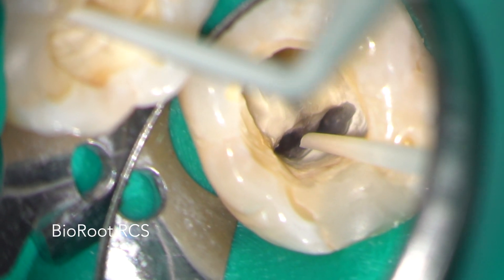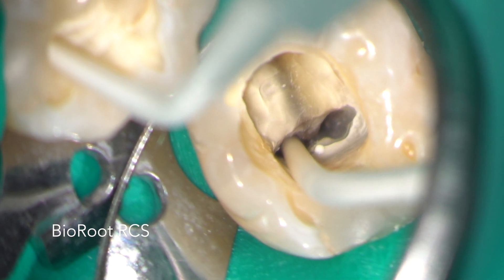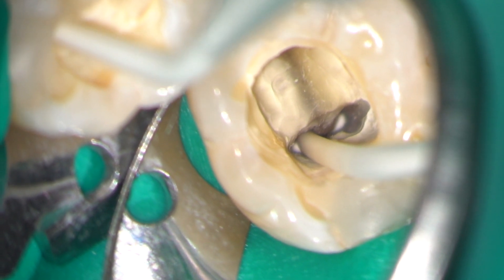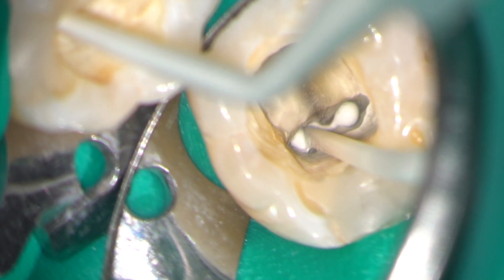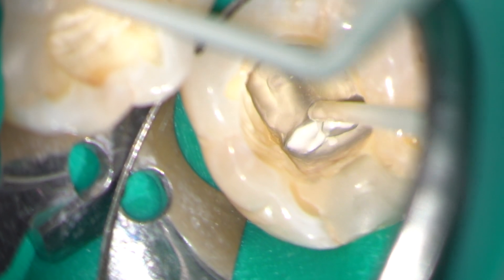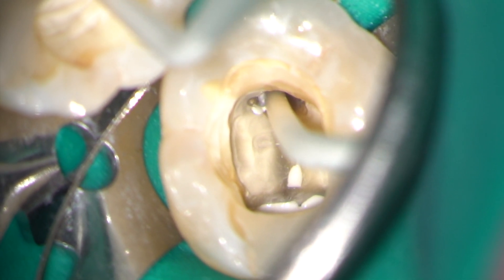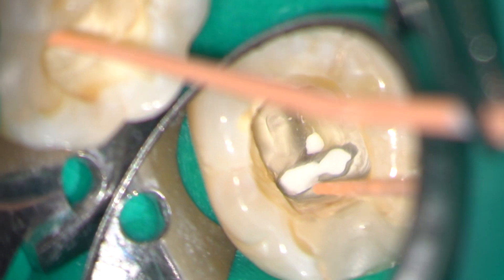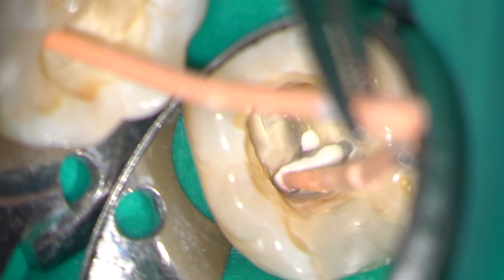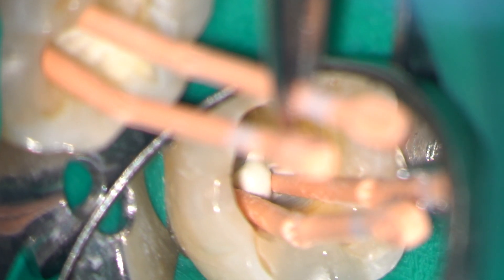I am using an injection technique with the bioceramic sealer and when I inject it in one of the mesial canals it flows through the confluence and isthmus and back up the other. Pre-measured gutta-percha cones are then inserted gently into the bioceramic sealer until they reach the working length, at which point they can be seared at the level of the pulp floor.